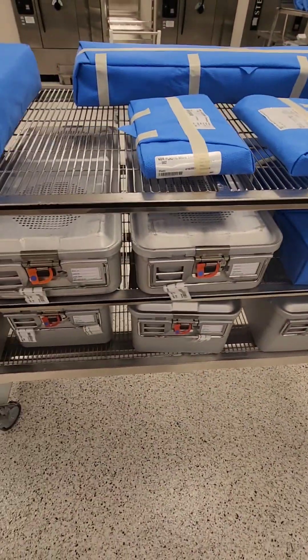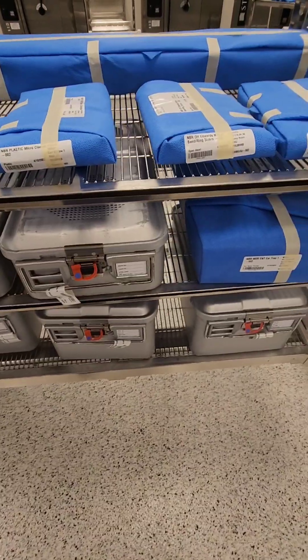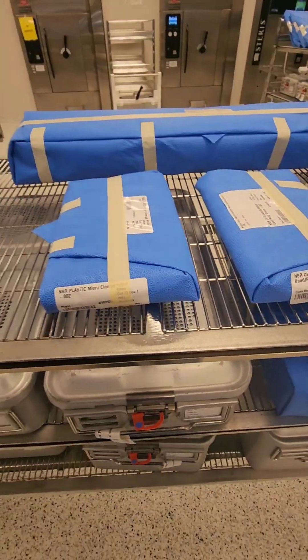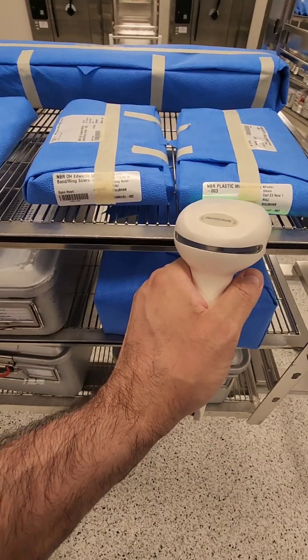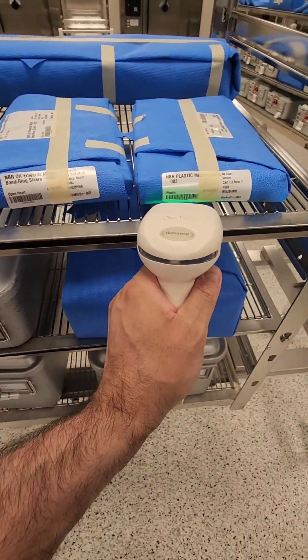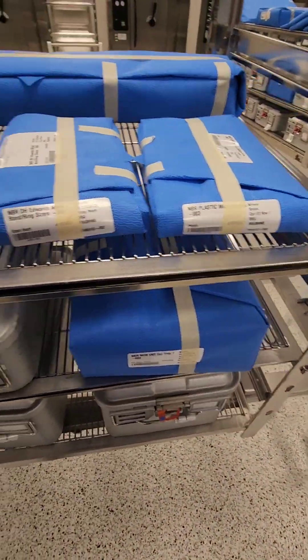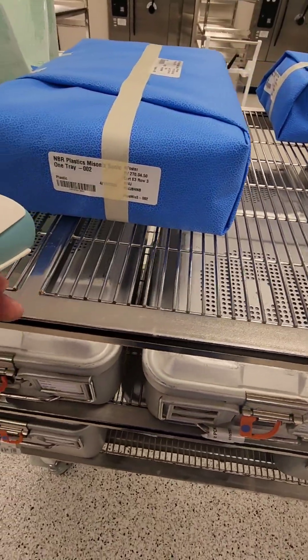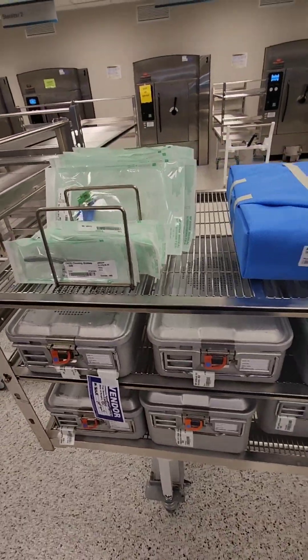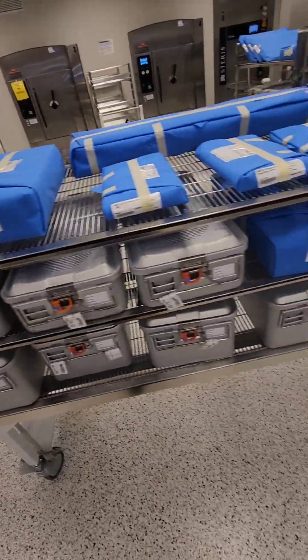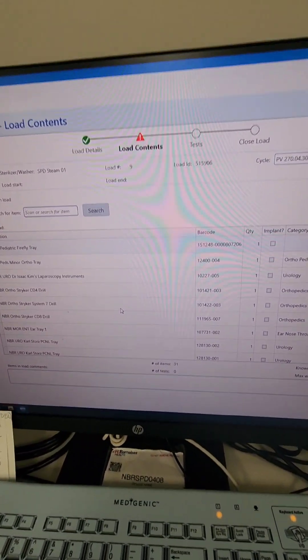We're going to go ahead and scan all of our items. When you scan, scan one row at a time — go ahead and scan across and make sure that it scans. I'm going to put this down to scan the peel packs because I wouldn't have been able to do that with one hand. I've scanned all my items and counted them — I have 31 items.